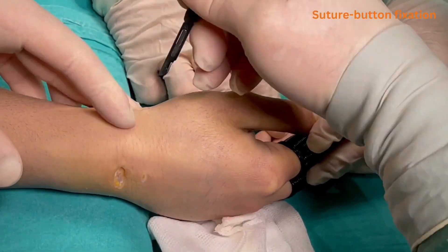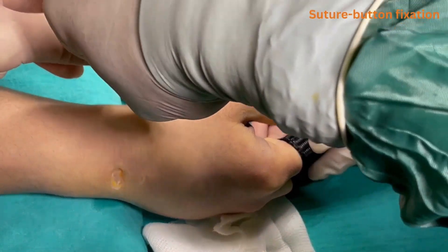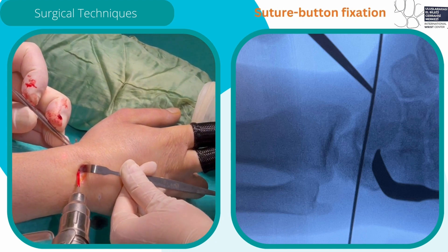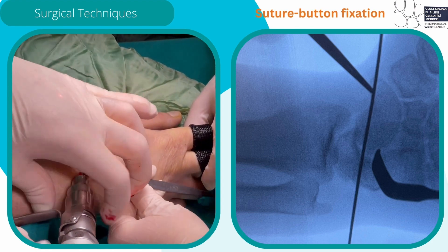A small skin incision is made at the level of the volar-radial aspect of the STT joint to allow exit of the guide wire and for passage of the suture button. A 1.1mm guide wire is introduced through the 3-4 portal incision towards the volar-radial aspect of the distal pole of the scaphoid.